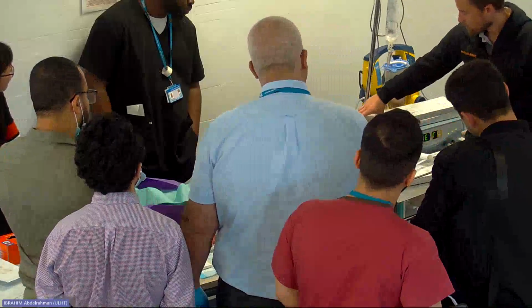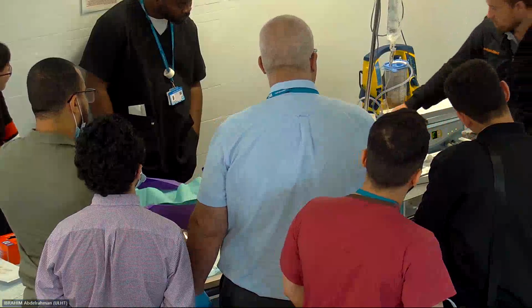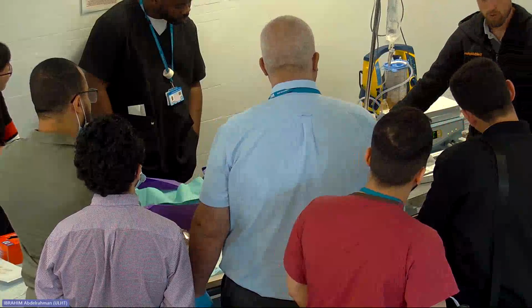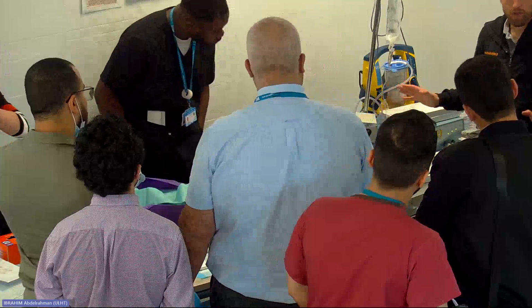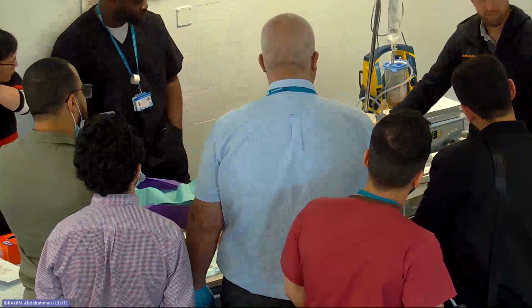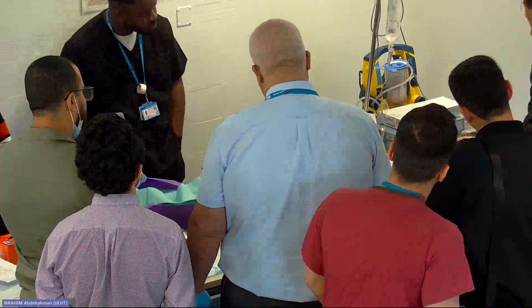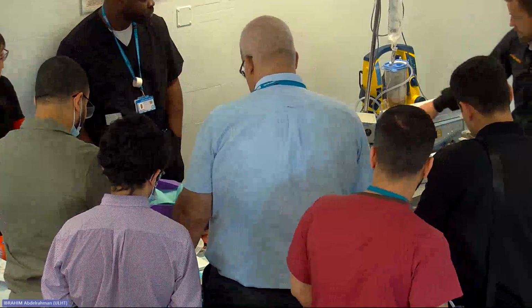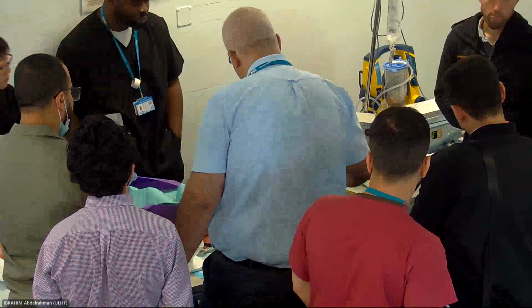Second thing is they'll put the tubing in, and it might be in the correct place. Then they won't flick it down to auto because they think light on means it's ready to go. It doesn't. Light on means valve open. So you put it down to auto, and then if you put your foot on the foot pedal, if one of you wants to demonstrate, the light will come on, the valve will open, saline will flow.